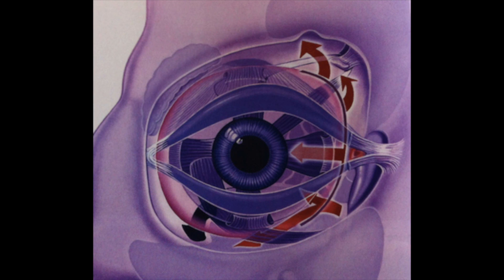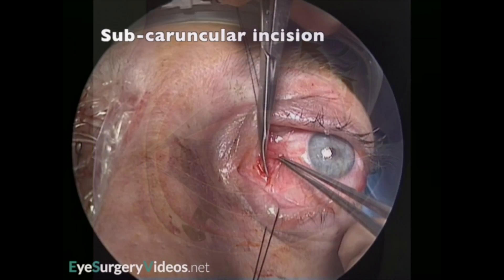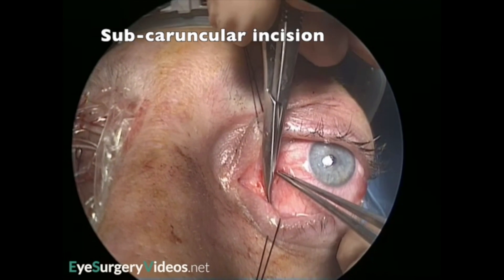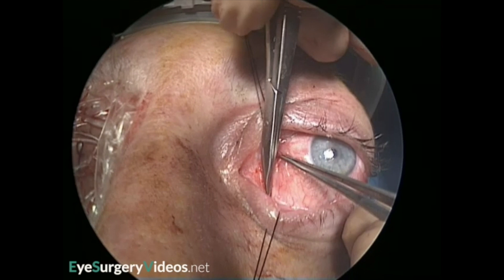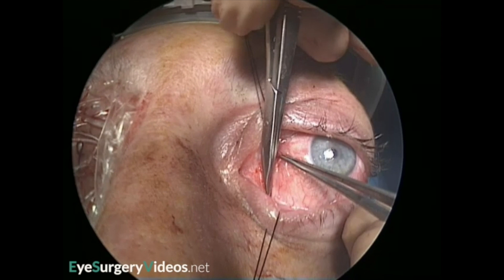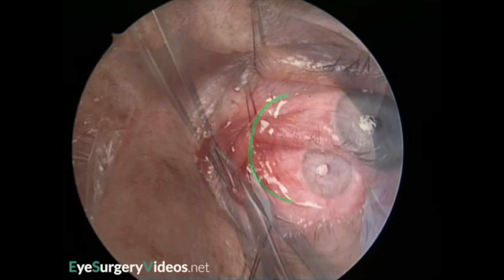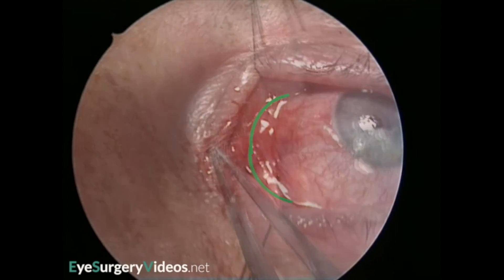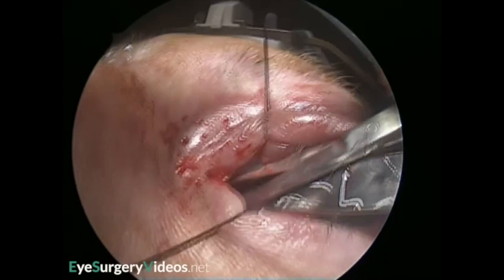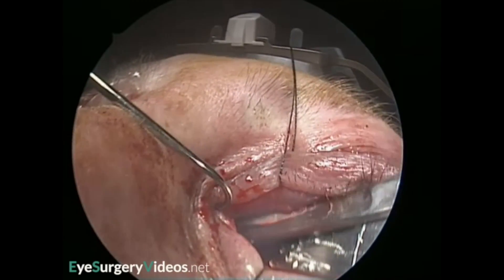The caruncular approach provides versatile access to the medial orbit. An incision is made between the plica and the caruncle. There is then an option to extend this in a crescentic-like fashion. Blunt dissection takes place posteriorly, aiming towards the posterior lacrimal crest.